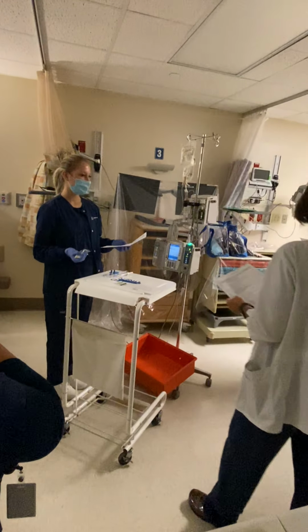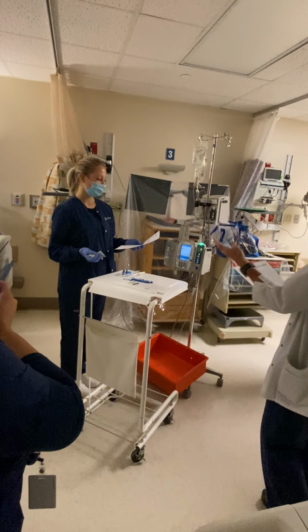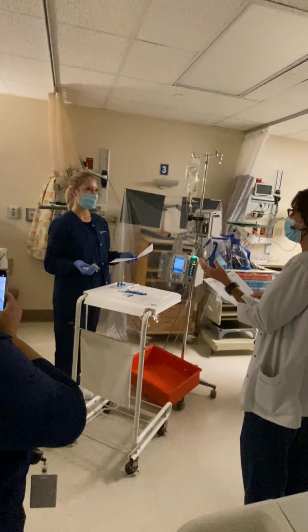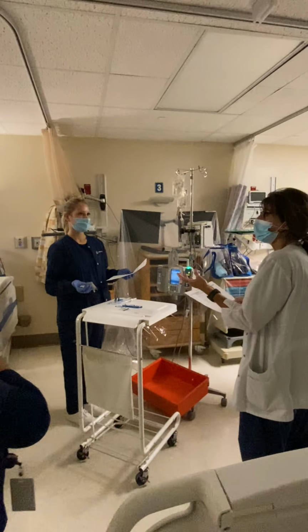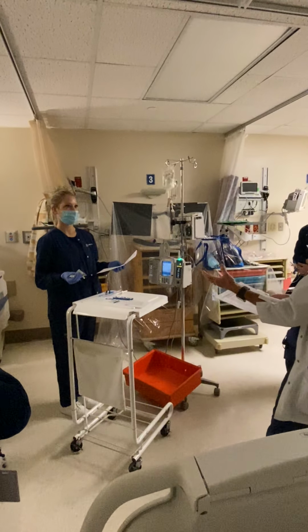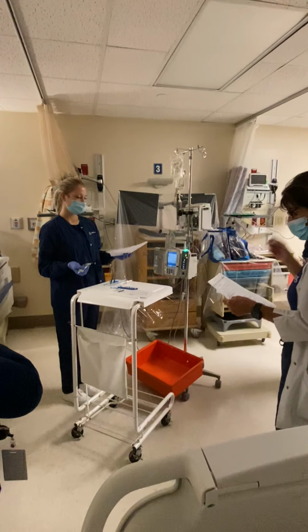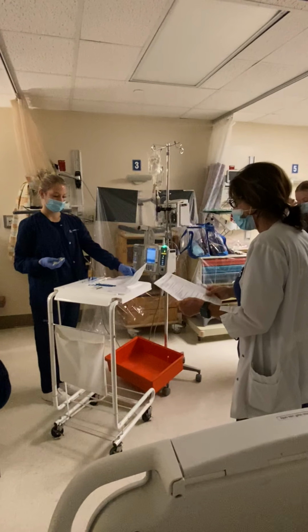Take a deep breath for a minute and think, okay, I did the right drug, I did the right dose, I did the right route, I did the right time. And the frequency you said it's every 12, I'm gonna give it now. But just make sure you verbalize, it's ordered every 12. I would check to make sure it was given 12 hours ago, so I'm gonna give it now. Okay? Okay, perfect. All right, so you have everything ready to go.